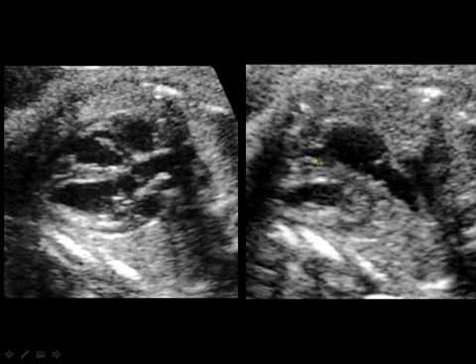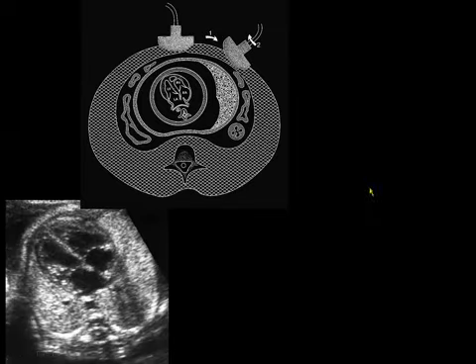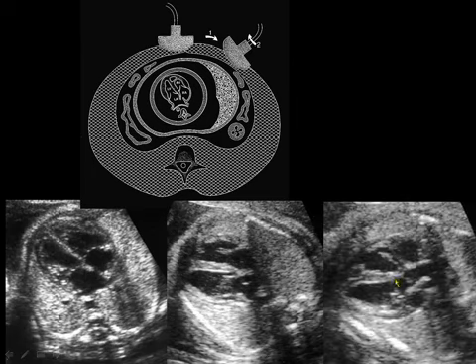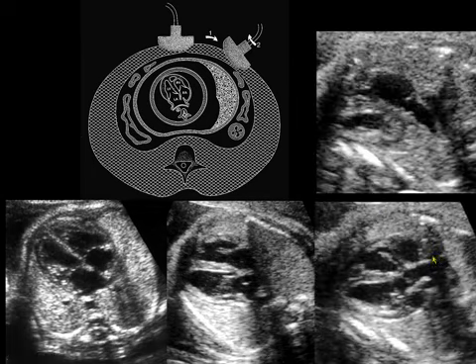We'll move to the ventricular outflow tract. This is the left ventricle, and this is right ventricular outflow tract, and then how to obtain these. If you go to the straight axial four chambers view, if you are scanning in the anteroposterior plane, you will see this image. Just tilt your probe to the side to scan the heart from the side, and then you will see the heart like that. You will see that your scanning beam is coming from the side. You will see that the four chambers is tilted to the side. And then from there, you just sweep up and rotate anticlockwise to see the left ventricular outflow tract, and clockwise to see the right ventricle outflow tract, just by sweeping up and a little bit of rotation.